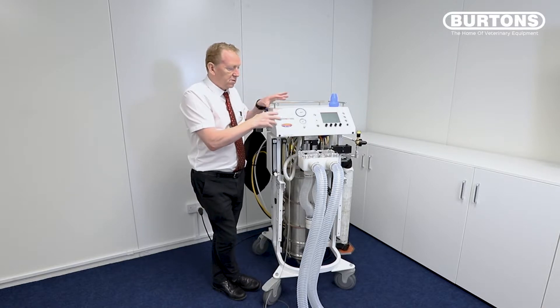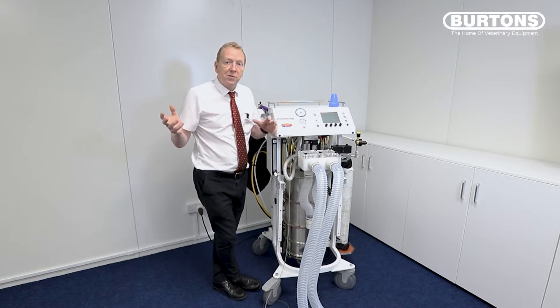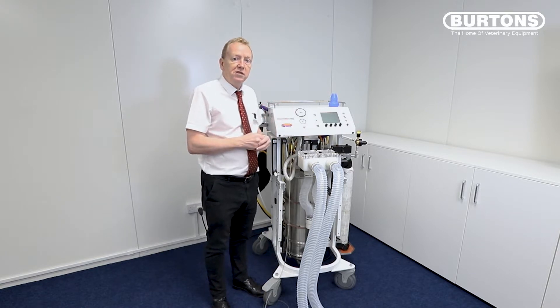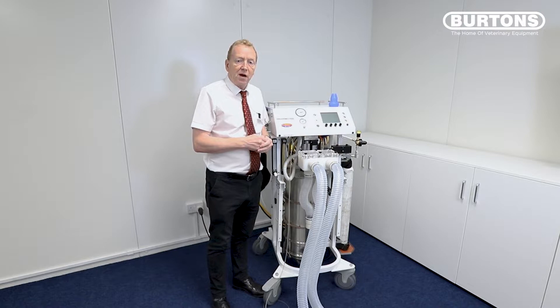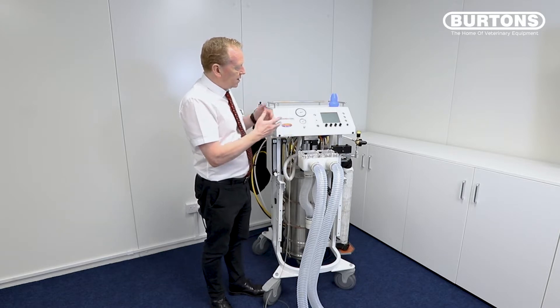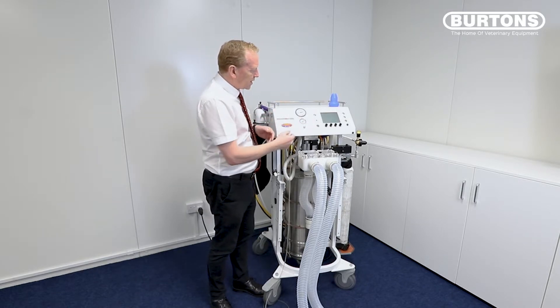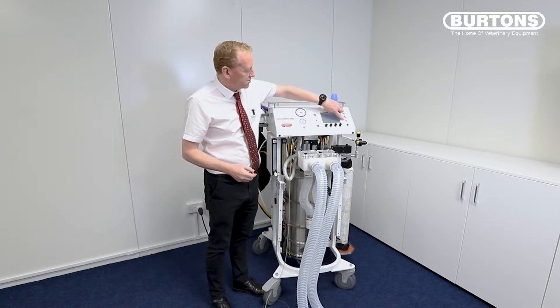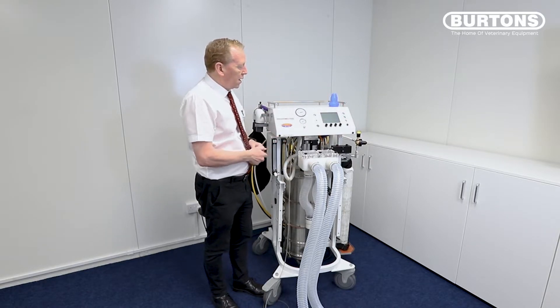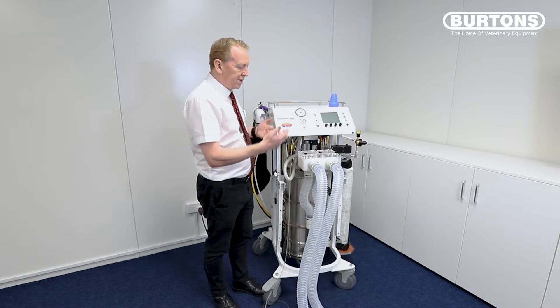So the idea is that you would turn the machine on, go about your business, get your syringes ready, get your ET tubes ready. You can hear what the machine is doing and it will alert you to a fault or just an alert, not necessarily a fault. Once it's gone through that initial self-test, we get to the point where the run stroke IPPV button is flashing — that's a request to initialize the piston.